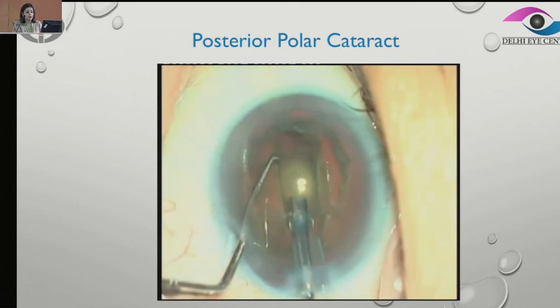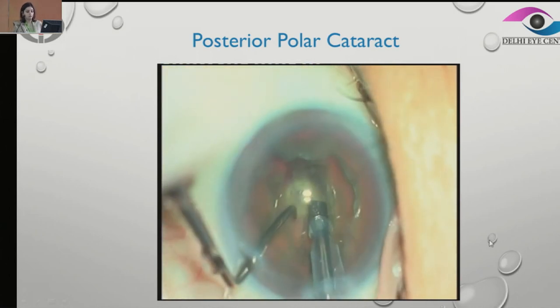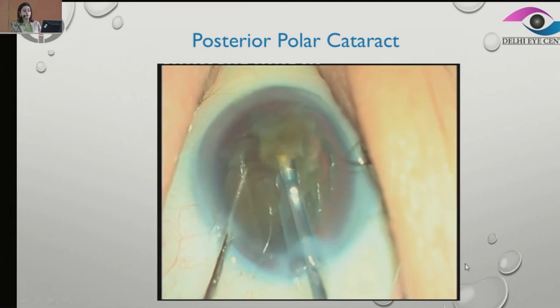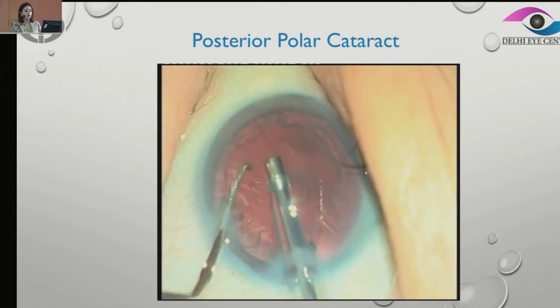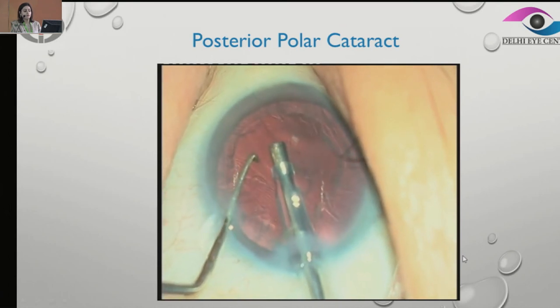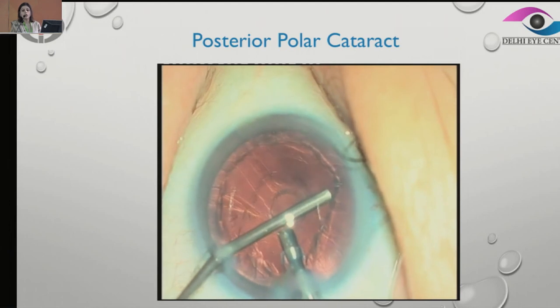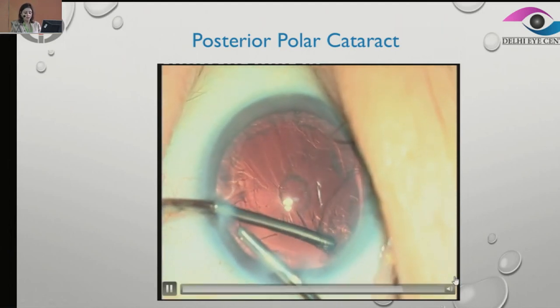Then we go ahead and make a trench. Crack it into two. Avoid any rapid maneuvers and avoid rotation as much as possible — just try to do it in the same position. And then, before withdrawing, it's very important that we inject viscoelastic so that we can maintain chamber stability and do not lead to a posterior capsular rupture.